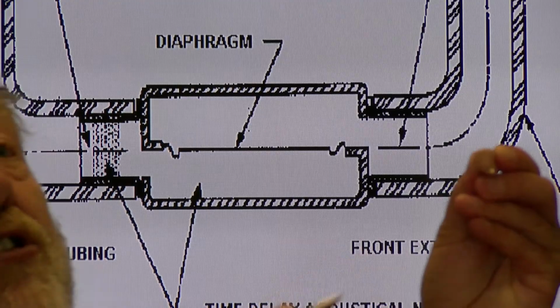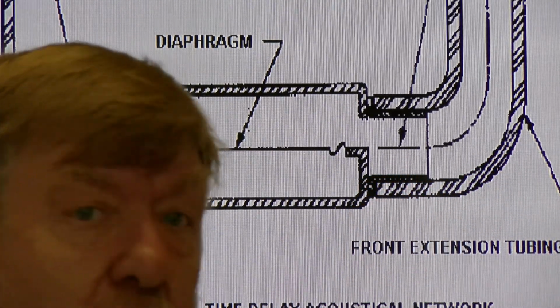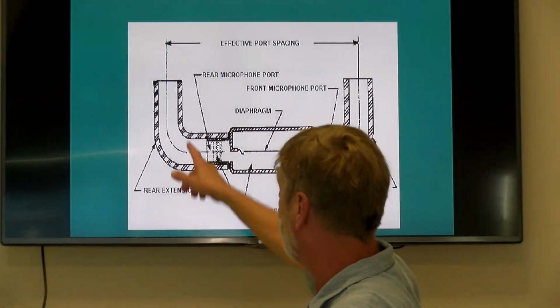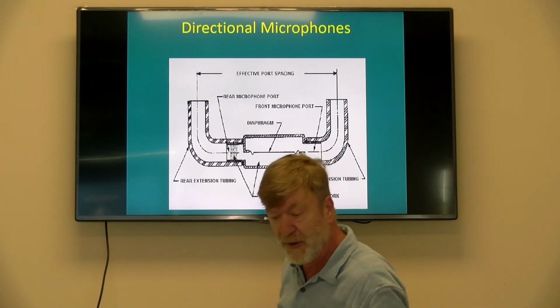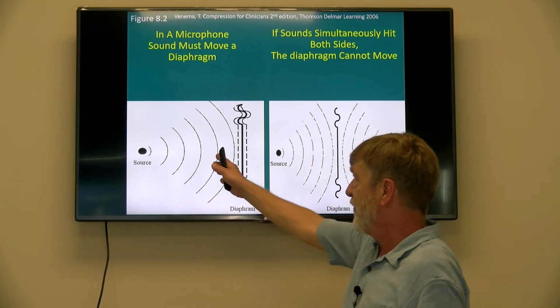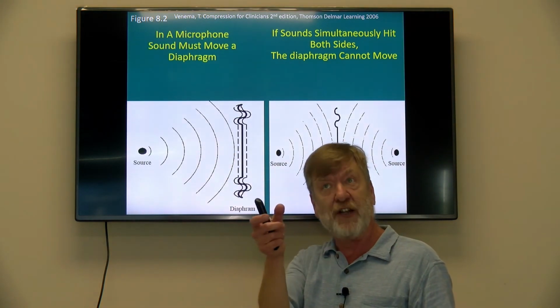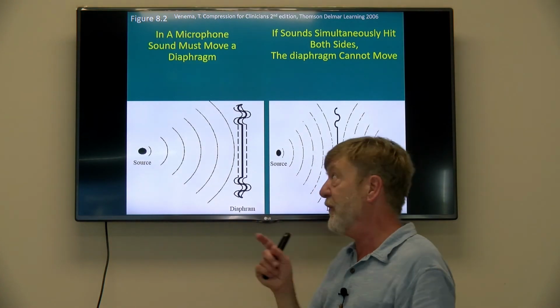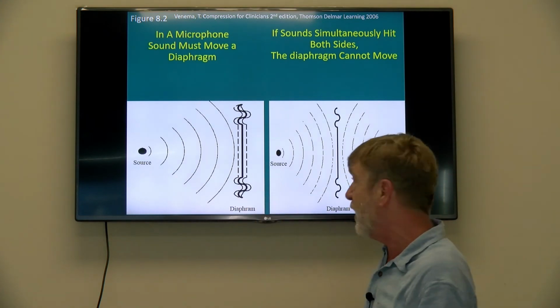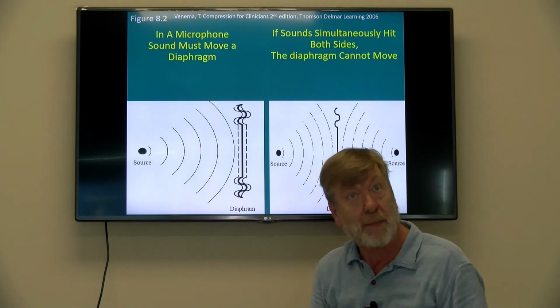That's going to be two separate little microphones. Difficult to see, but if you look at a hearing aid close up, when you see two little dots on it, that's a directional microphone. It means it's got one entry here and another entry there. Why and wherefore? What does that do? If sound wiggles a diaphragm in a microphone, it changes sound into electricity. But if sound hits that diaphragm from opposite directions at the same time, cancellation. Or the sound of one hand clapping.